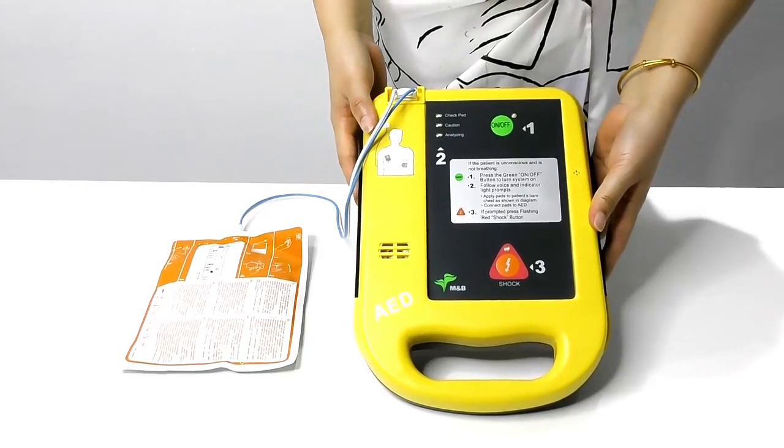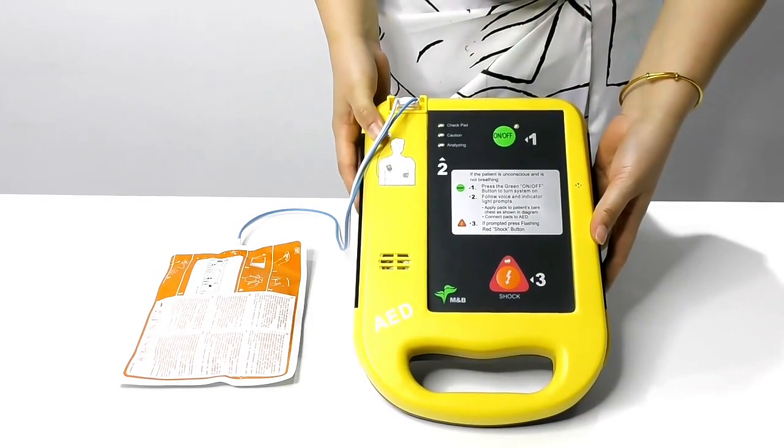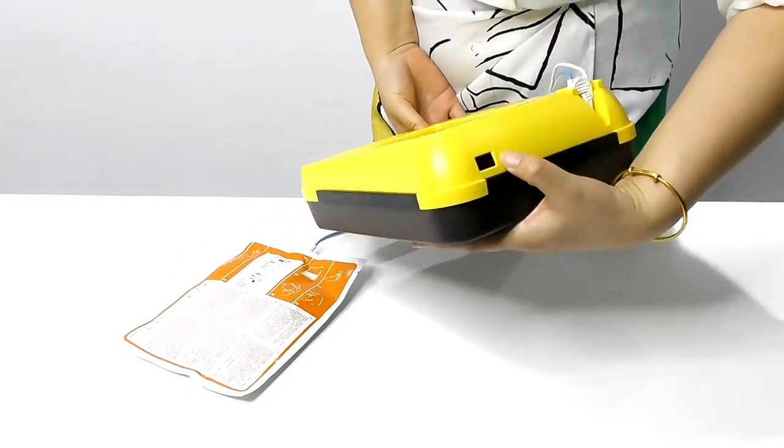Here is our AED-7000. It's a CE-approved automated external defibrillator biphasic energy output. Infrared transmission.